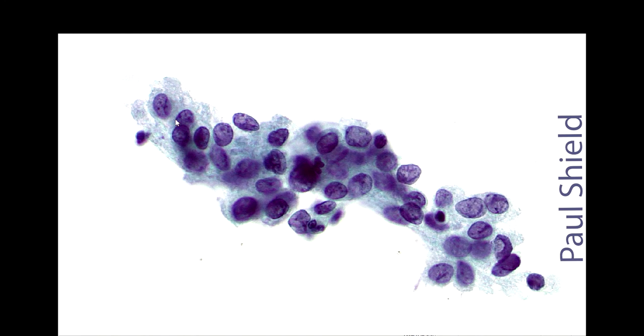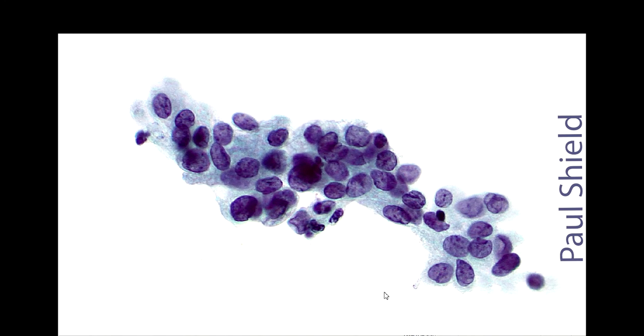Not many of them are nice and perfectly round. That one there is fairly oval, but a lot of them are more teardrop shaped, like that one, and they have coarse but even chromatin. So these are high SIL in what I would call a loose sheet. It's only maybe two cells deep at the most.